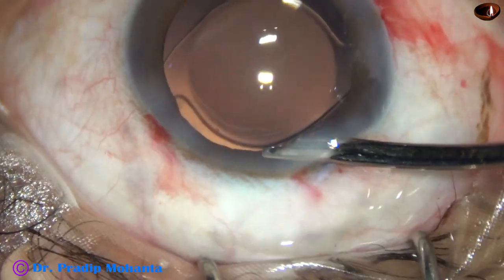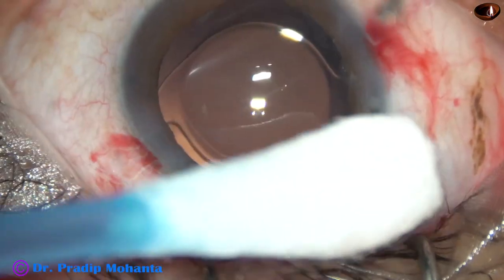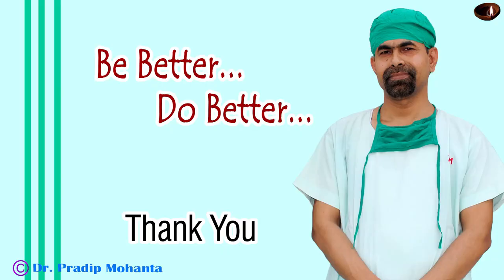The anterior chamber is formed nicely and integrity of the wounds are checked. There should not be any leakage from any side. A few drops of moxifloxacin are applied and the case is concluded.